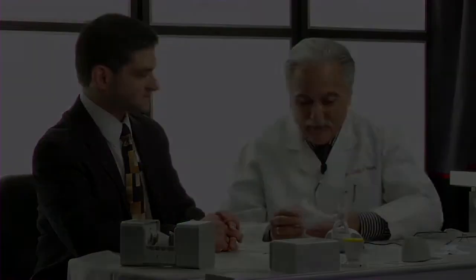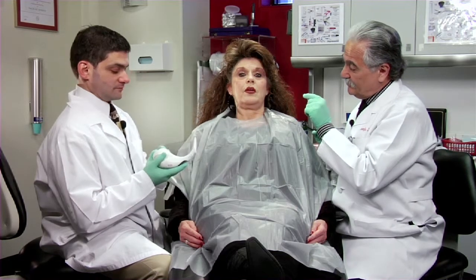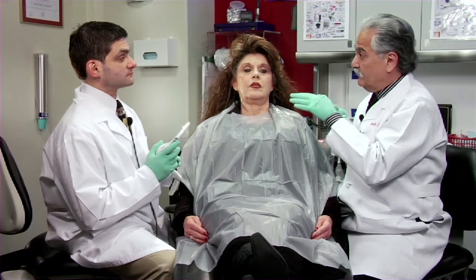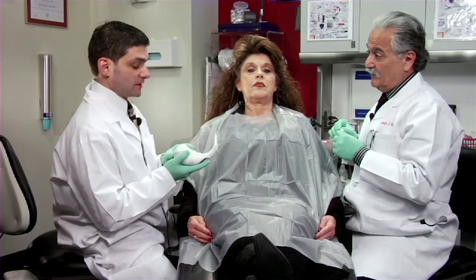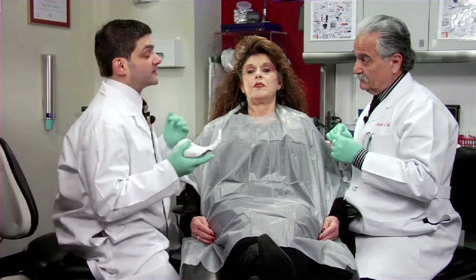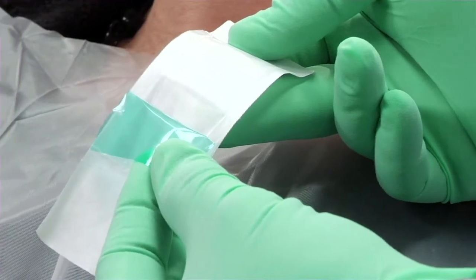Let's go into the operatory and demonstrate this on a patient. In this particular situation we're going to do only a single crown — tooth number nine. Since we're not doing any other crowns, it's very important not only to take the shade on the tooth we're going to crown, but also on the adjacent teeth, so we can give the technician at least two shades. We'll take shades on tooth numbers eight and ten. I've put on an infection control shield and calibrated the unit one more time.